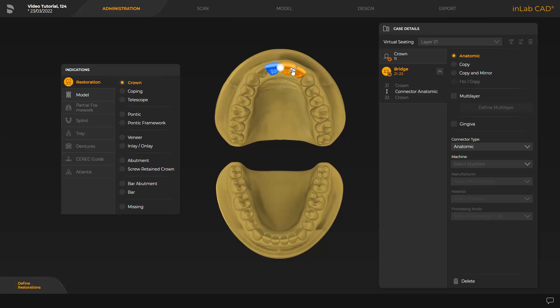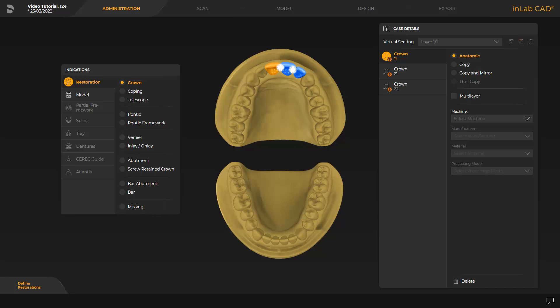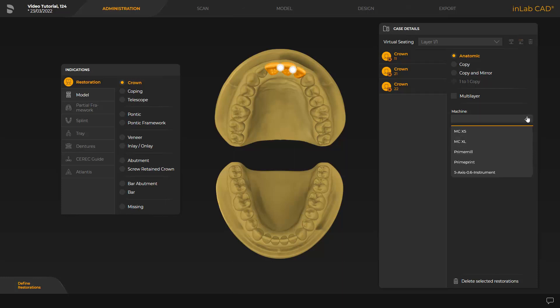By tapping this connector once again, the intersection connector is selected. We tap a third time so that the connector is removed. Next, we determine our case details. To determine these at the same time for all three crowns, we tap the first crown and simultaneously press the Ctrl and A keys, which marks all three tooth positions in yellow. We then go to Machine and select the PrimePrint option.